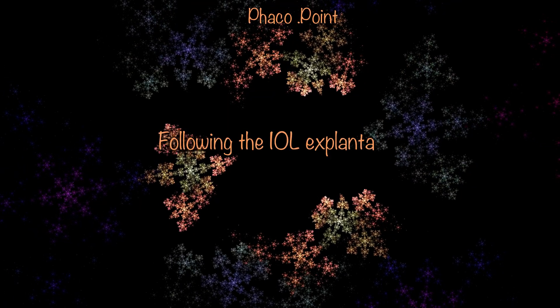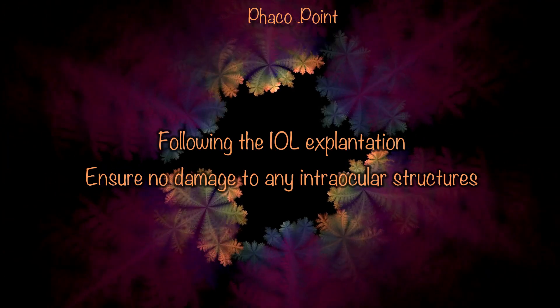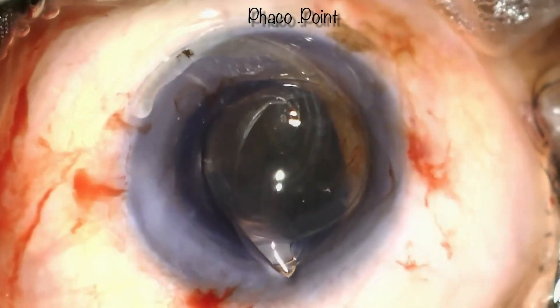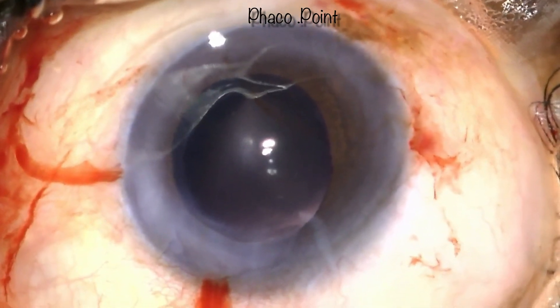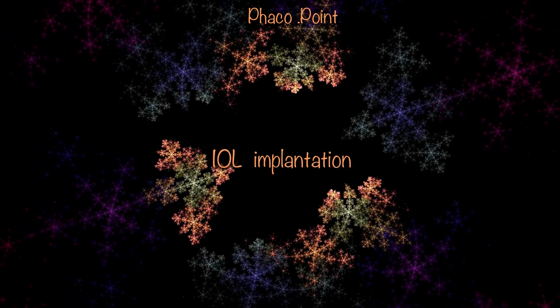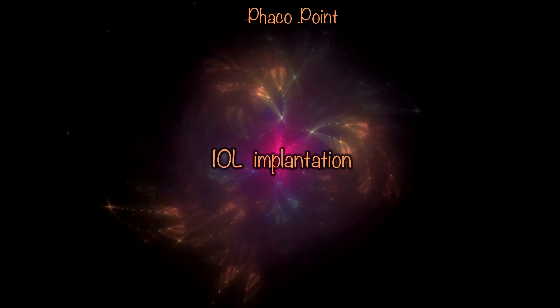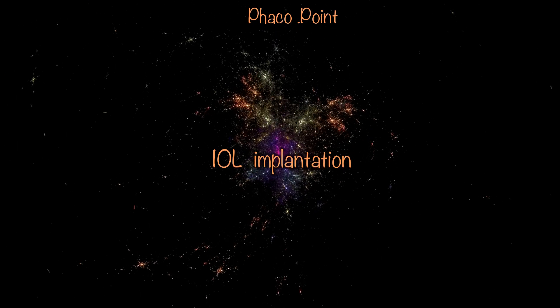Once the IOL is explanted, it's important to look for any signs of significant damage in the eye. Look at the corneal endothelium, look at the iris, and ensure there is no damage to the posterior capsule. Having ensured the above, you can then proceed to implanting a new IOL into the eye safely within the capsular bag. To do so, we first insufflate the anterior chamber and the capsular bag with viscoelastic, then proceed to IOL insertion.